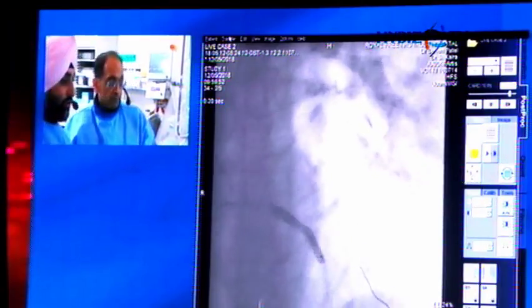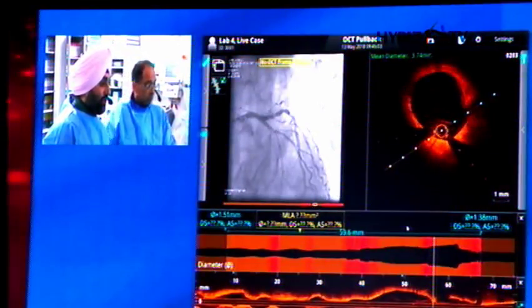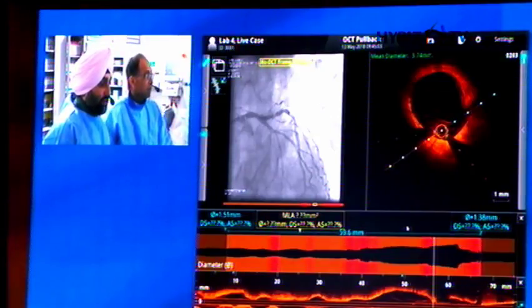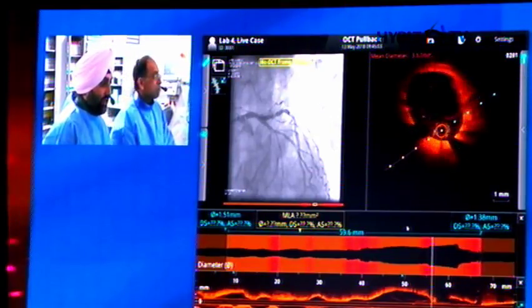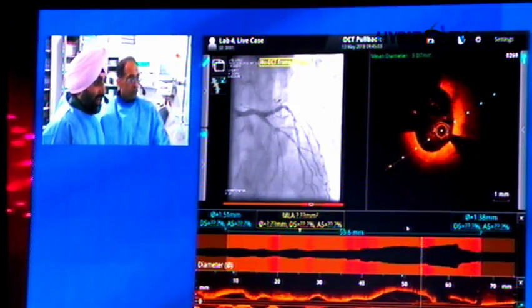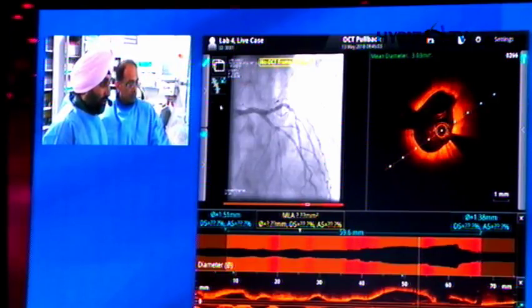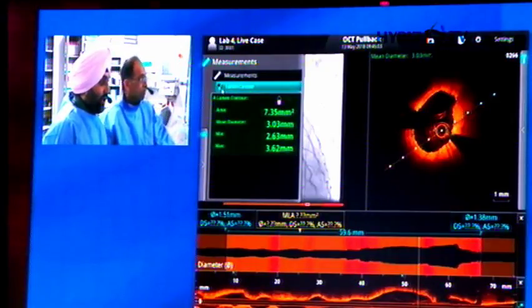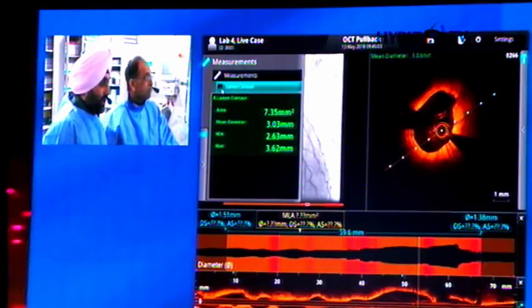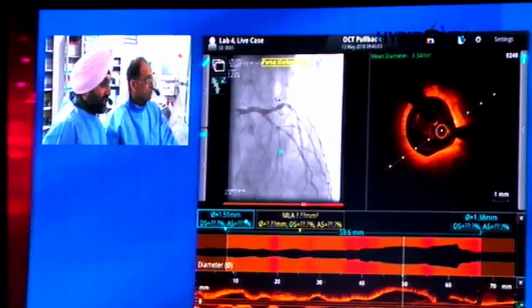So if we could just switch back to the OCT again now, I'm just going to show you how we decided what we were treating there. So if we go back to the OCT feed, please. Okay, so we're on the OCT feed now. I'm in the left main stem on the axial view there, and I'm going to drive distally, and you can see the circumflex just coming in there, and that's the LAD ostium just there. Okay, so if we again look, there is atheroma at the ostium of the LAD. Looking at what we've got, a luminal diameter there of 3.0. And if I go on, we were planning to land somewhere in the LAD just around there.